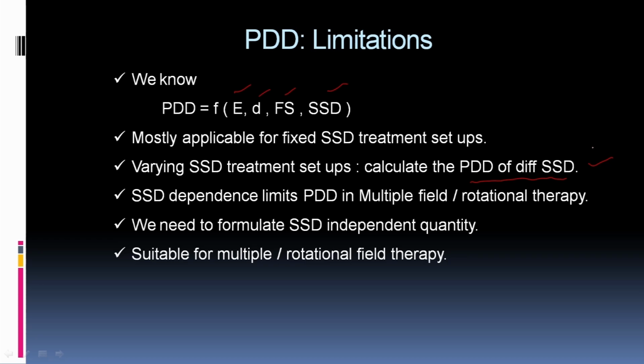So SSD dependence limits the use of PDD in multiple or rotational therapy. We will not be able to use the percentage depth dose as the central axis depth dose parameter. So we need to formulate an SSD independent central axis depth dose parameter, which will be suitable for multiple or rotational beam therapy.